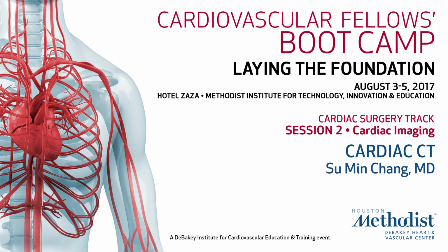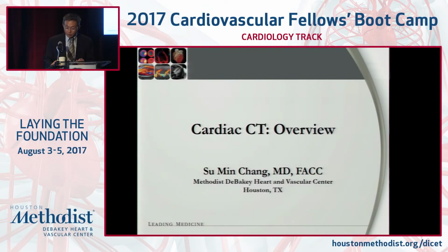Okay, second part is cardiac CT. At Methodist Hospital, we have 3 cardiac CT readers. We also have a nuclear cardiologist, which is kind of a trend in the country: if you do nuclear cardiology right now, most people would also do CT. They fit into each other because the main application of cardiac CT right now is coronary CTA.